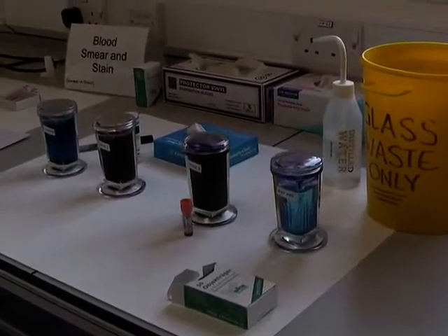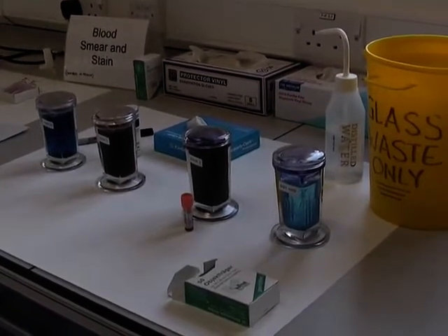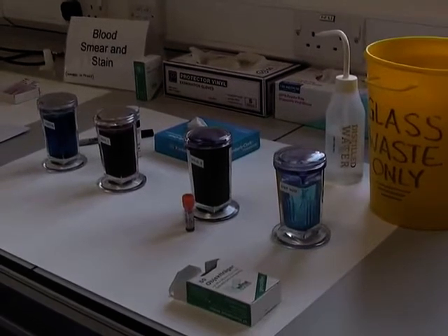This demonstration will show you how to prepare a blood smear for differential staining in order to identify white blood cells.